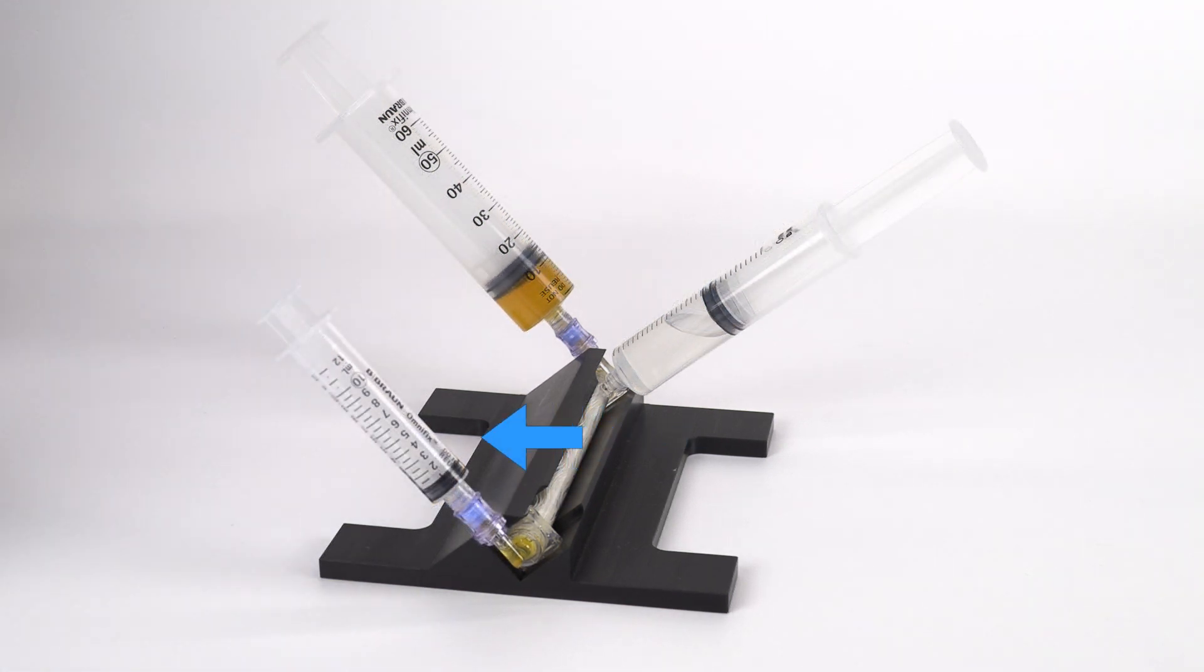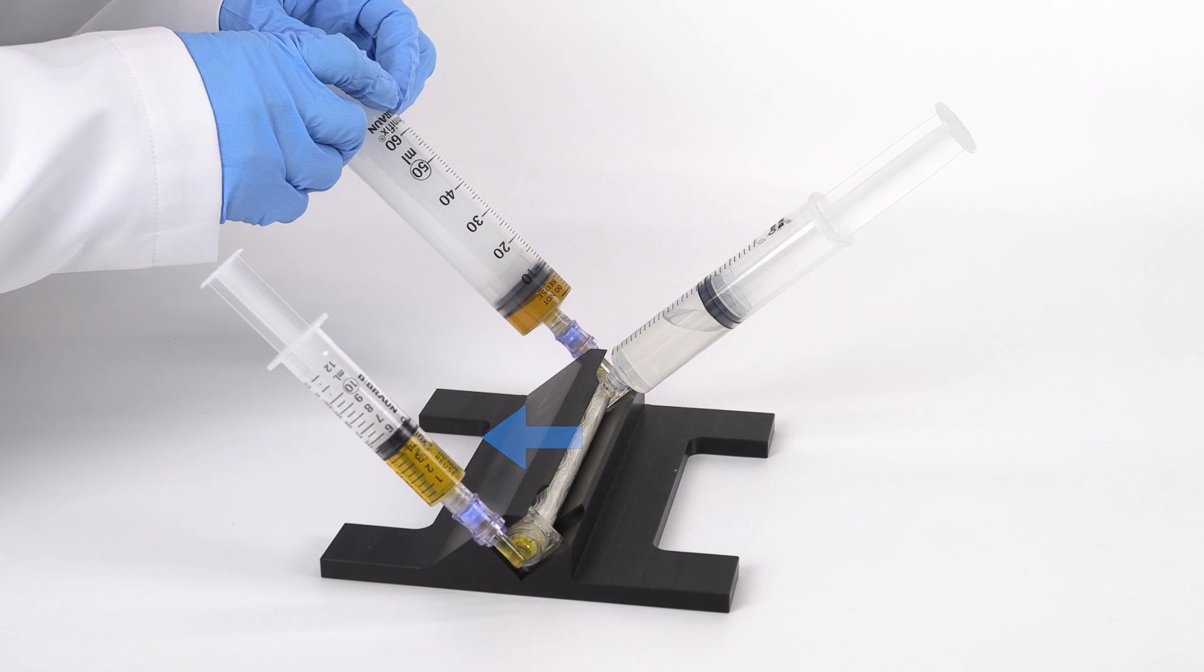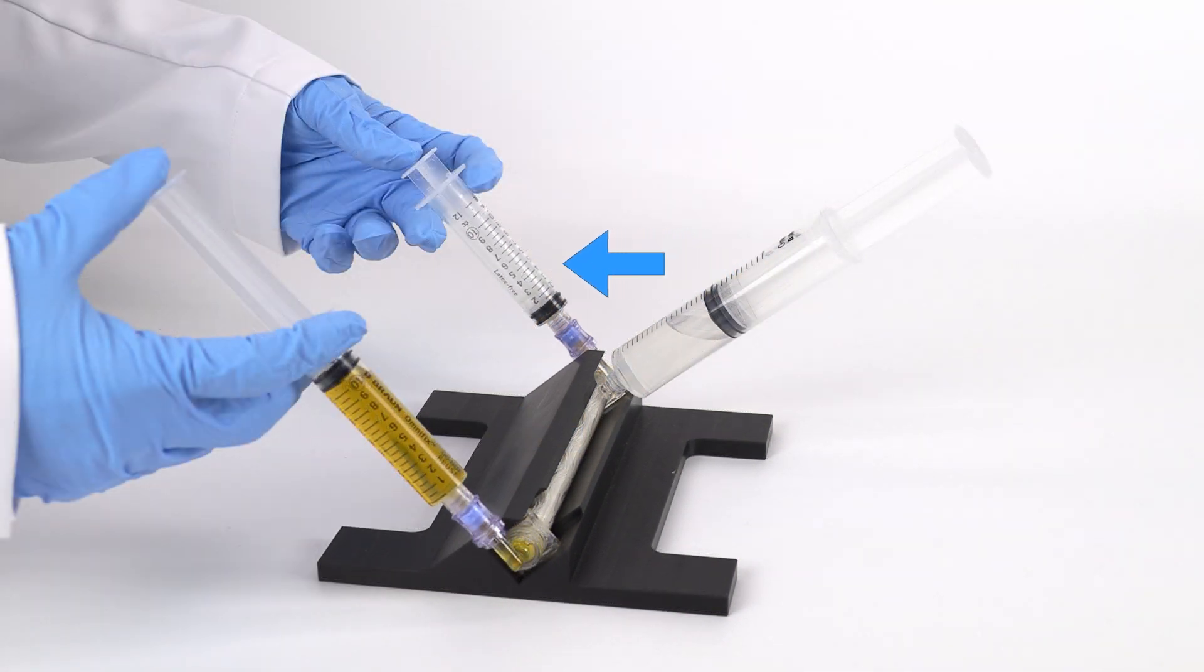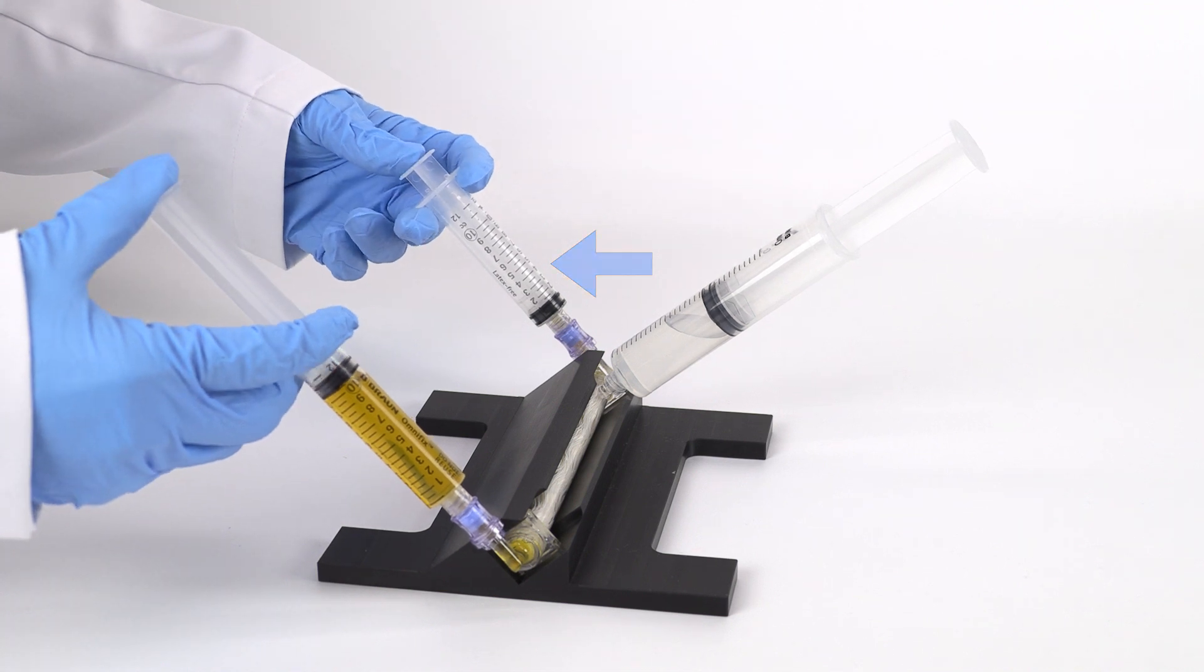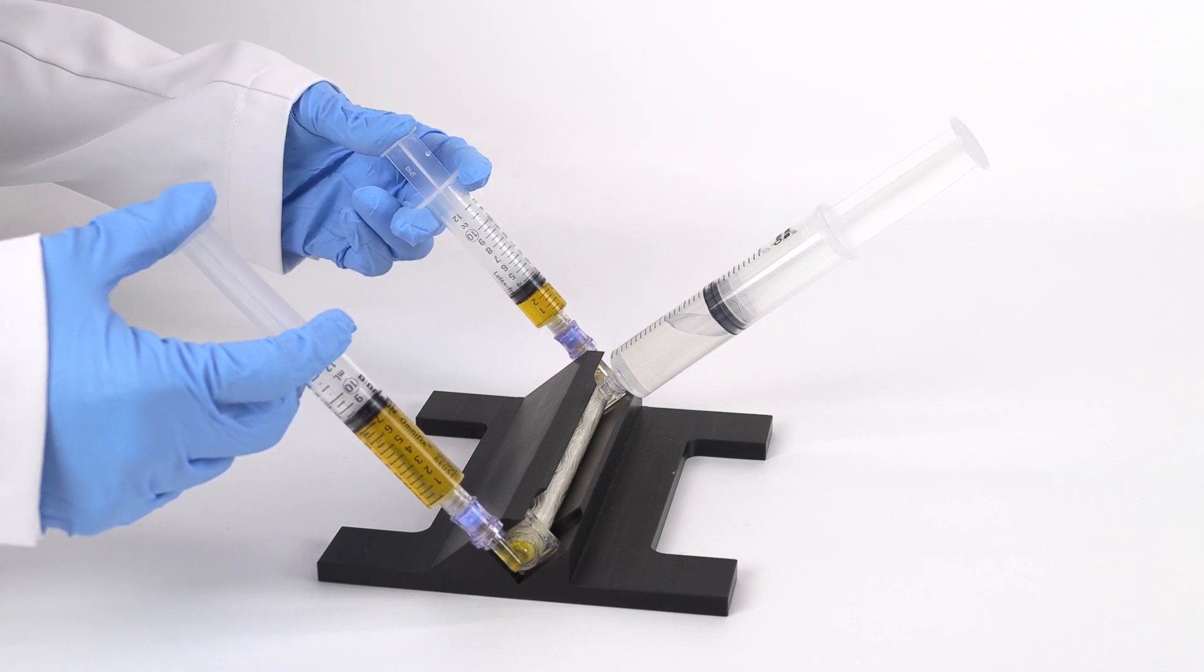Replace the empty syringe with a 12 milliliter syringe. Inject the plasma into the 12 milliliter syringe. Replace the second empty syringe with a 12 milliliter syringe. Continue the filtration process by injecting the plasma back and forth through the 12 milliliter syringes.